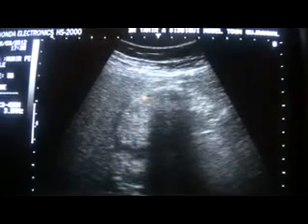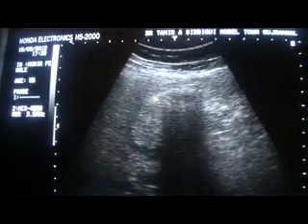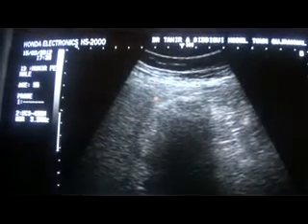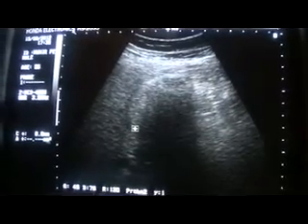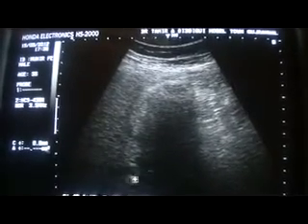This is the area of the gallbladder, measuring 6.7 centimeters by 4.3 centimeters, with this being the portal vein. This is the liver surrounding, and now we proceed further into further details.